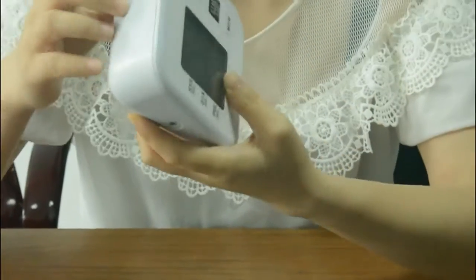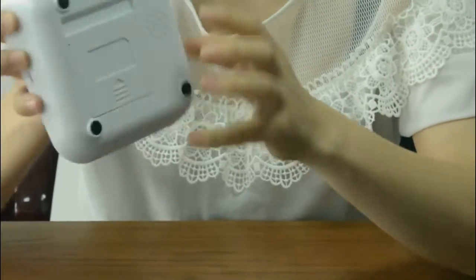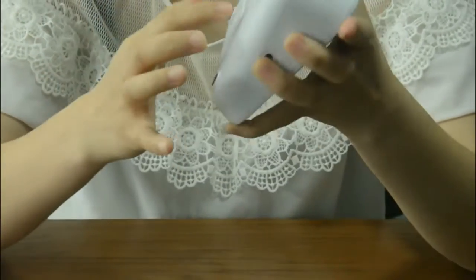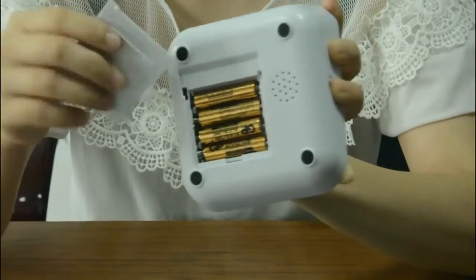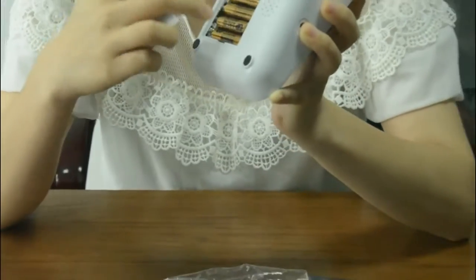The back part of this device is the battery compartment. You can open it. We have already placed the battery inside.